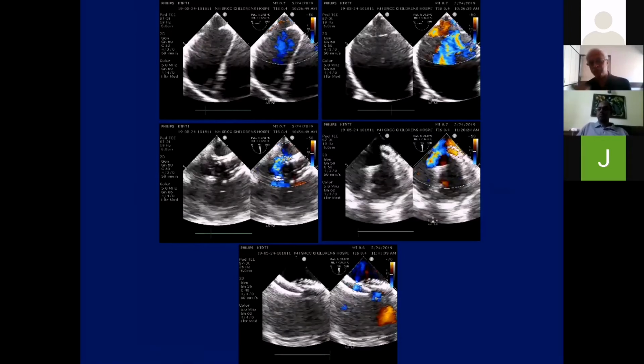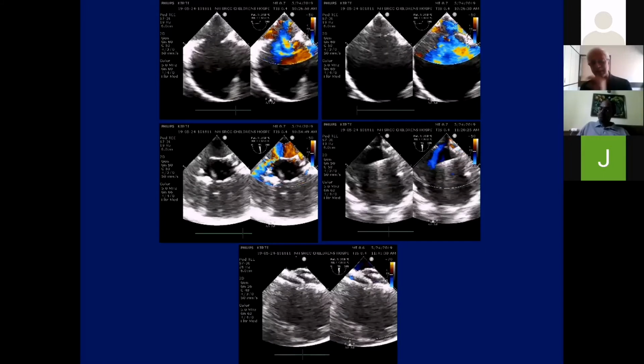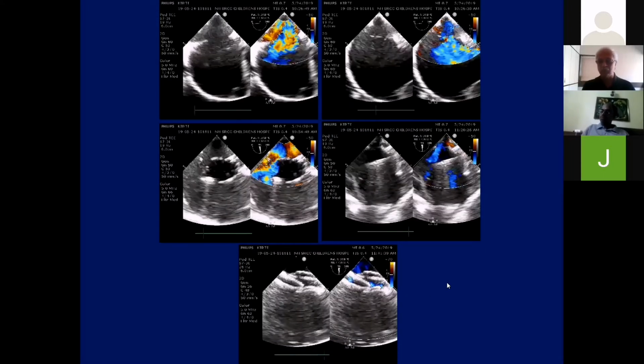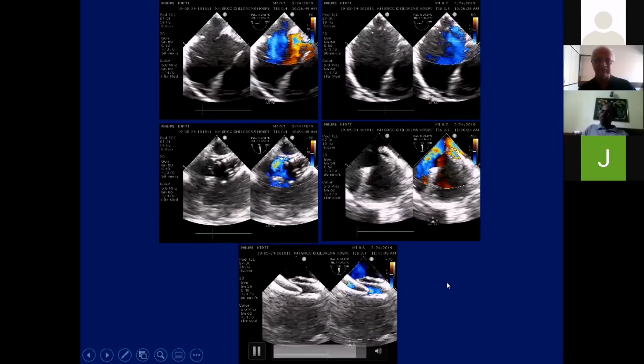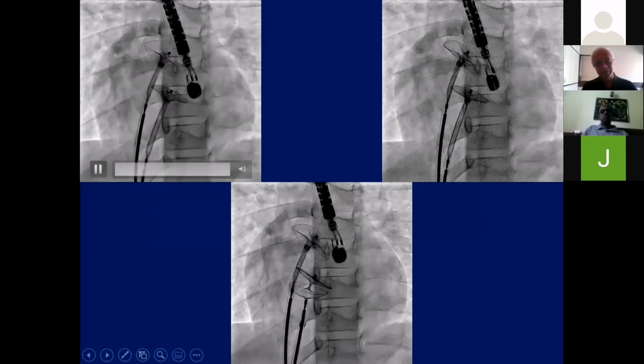So you have the septal occluder to close the larger defect, and you have a Cribriform device to close multiple defects in septum primum. Now, this is what happens many times when you close the larger defect with a septal occluder and you want to get back to the fenestrated device, it may be difficult.